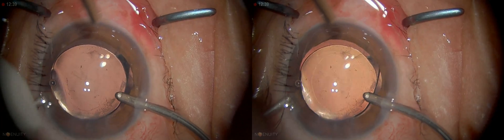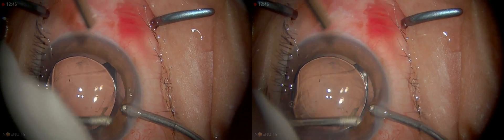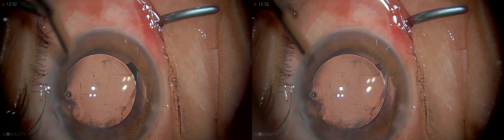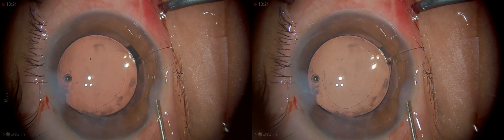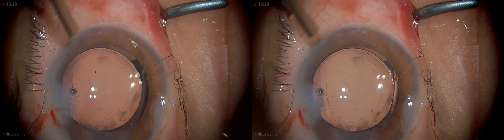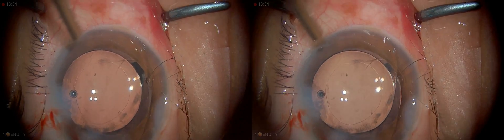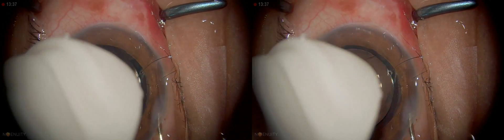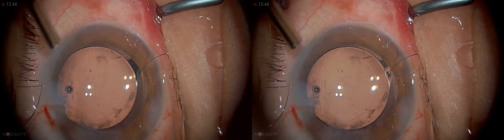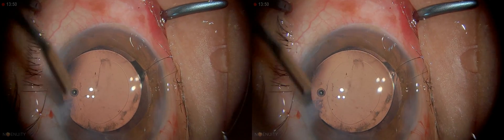Always go in with the infusion first and then take this out. We'll just clean up the subcapsular area a little bit — it's always nice to have a clean capsule. Visualization of the retina is better when the capsule is polished. It's always good to over-inflate it a little bit, but remember at the end you need to tap it so that the intraocular pressure is not high, because that causes two problems: it causes pain to the patient post-operatively as the block wears out, and it will also endanger the optic nerve. The last part is to give some intracameral Vigamox, which I always do — just a little bit is enough — and some on the cornea as well.